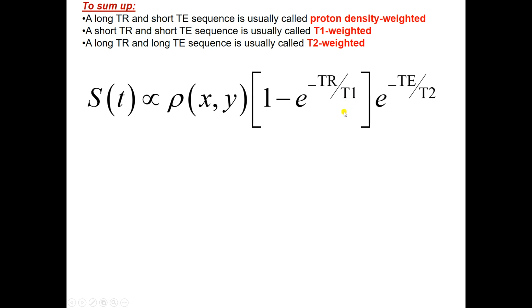In the T1 weighted image, T1 is about equal to those TRs, but for one of them, T1 is quite small. So when T1 is small, like it is for fat, whatever you've chosen for TR, you're dividing it by the small number. So that's e to the negative big thing. 1 minus e to the negative big thing is close to 1. That's going to be bright.